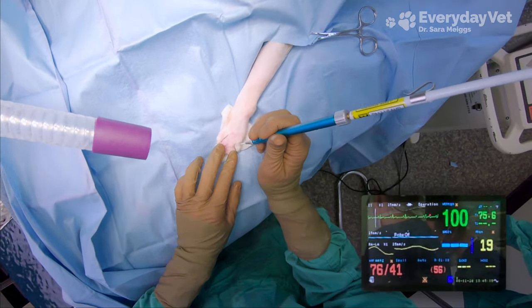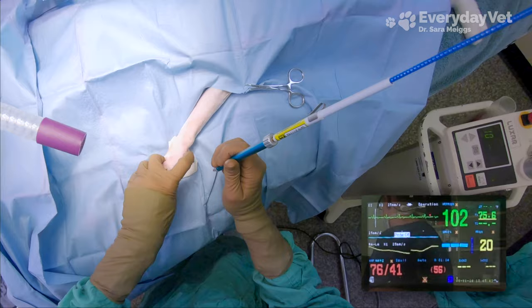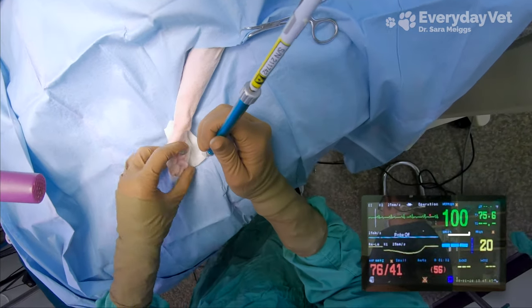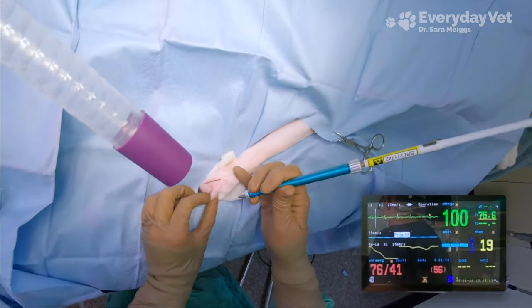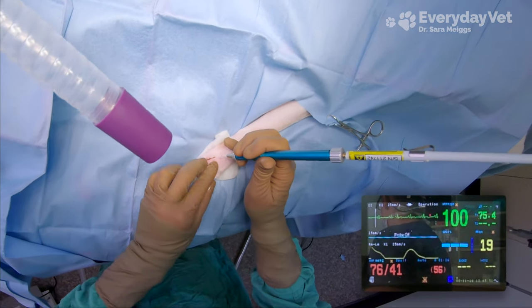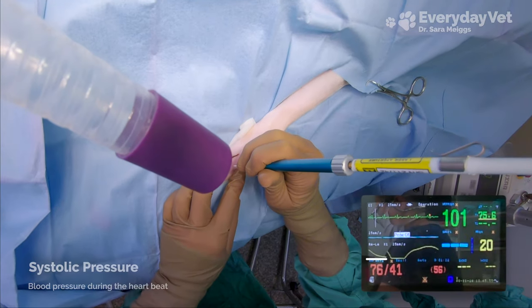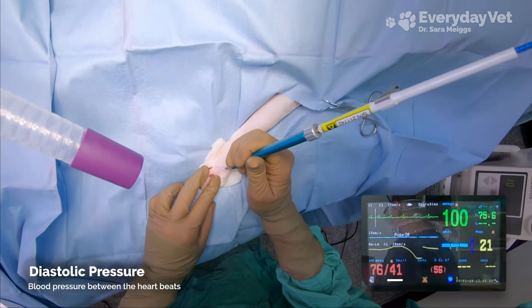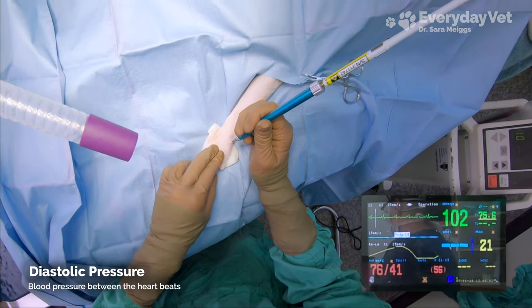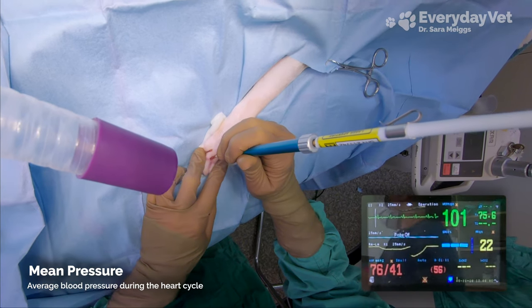Let's take a look at the Cardell. The patient is hooked up to EKG leads, which allow the Cardell to monitor his heart rate — that's going to be the green number in the top right. In an anesthetized cat, we want the heart rate to stay above 100 beats per minute. The red numbers in the lower left are the blood pressure. The first number is systolic pressure, which is the blood pressure as the heart is beating, and the second number is the diastolic pressure, which is the pressure in between the heartbeats. The number in parentheses is the mean pressure, which is the average throughout the cycle.